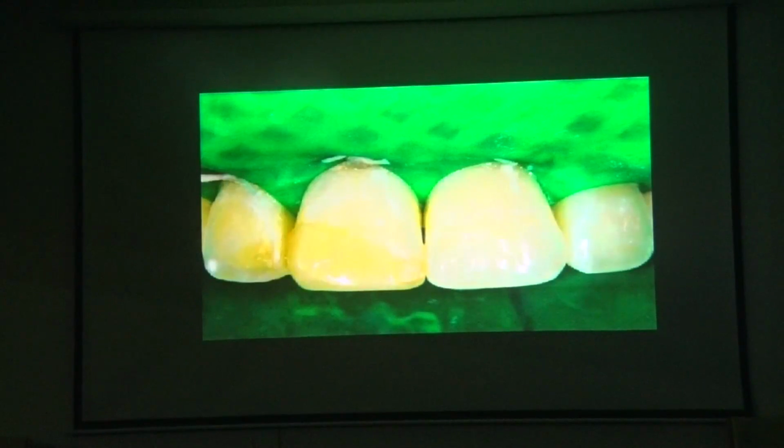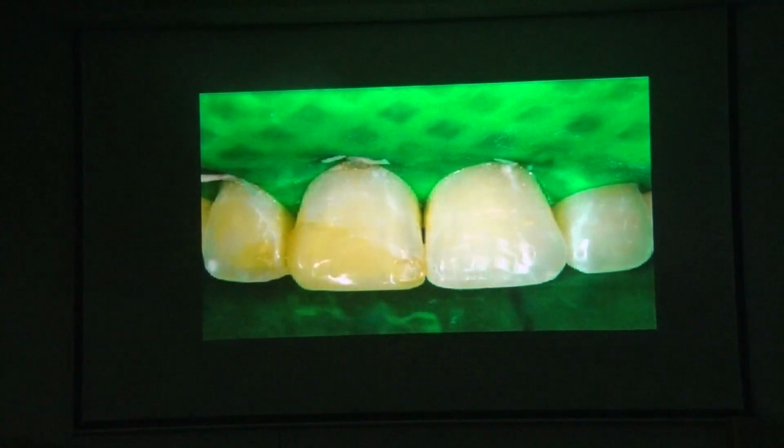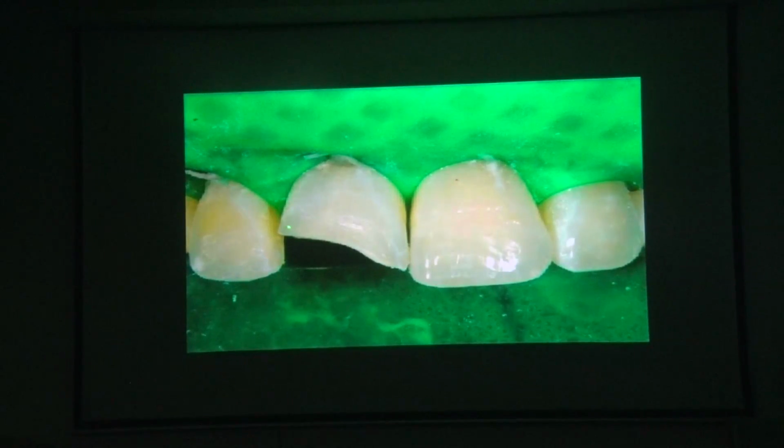Say for example, I am doing an angle build-up of this. So I have given a long bevel. Can you see that? It's a long bevel, 2 millimeters wide. Width is very important. Don't be too conservative here. If your width is less, then you will not get a good merge. 2 millimeters, 0.5 depth. Now I can see this line. I need to break this line.